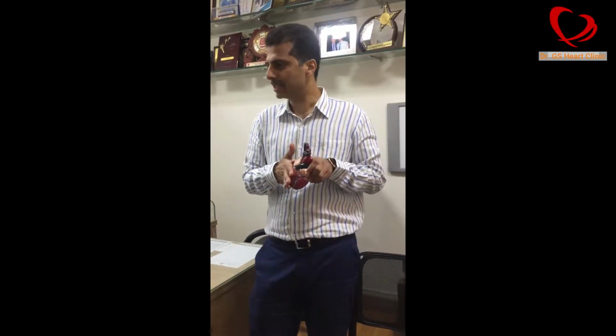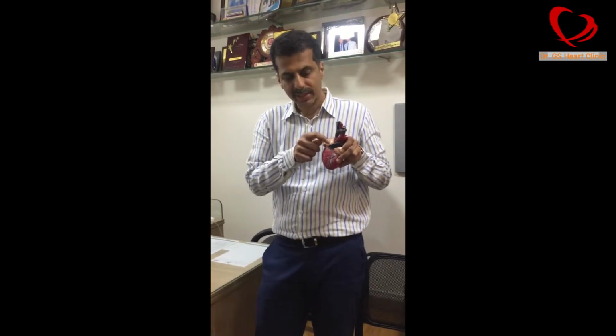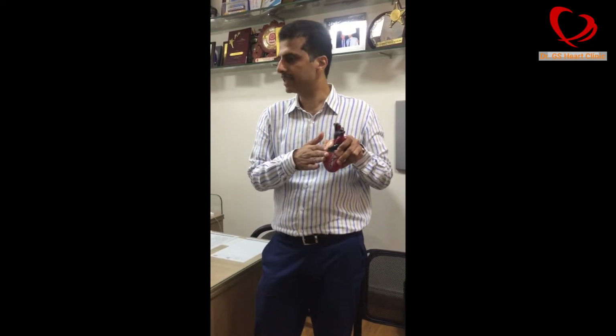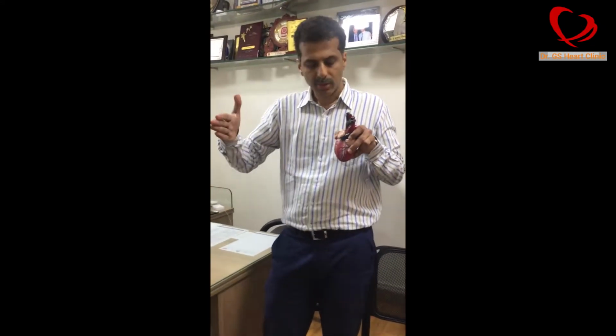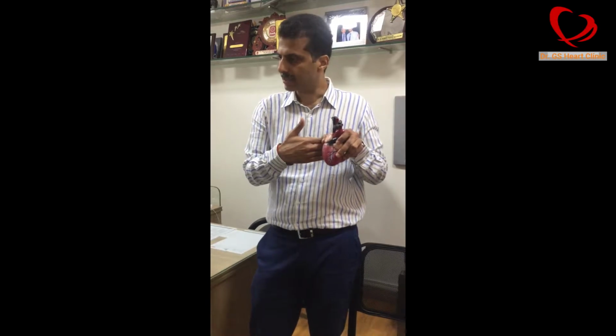An angiogram is a two-dimensional imaging, which means X-rays are taken and the dye is injected. Once you inject dye, these arteries will be visible by X-ray, otherwise they won't be visible. So we take X-rays from this angle, we move the machine to another angle, take X-rays from this angle and from this angle.